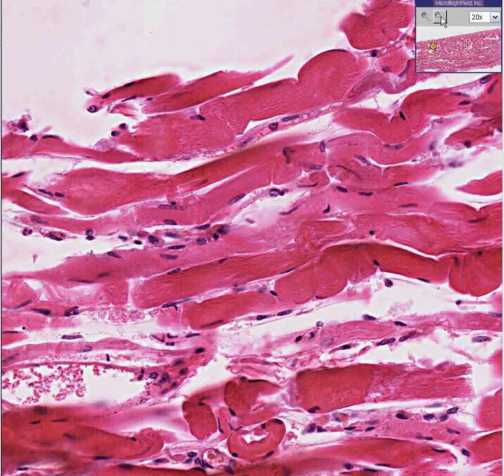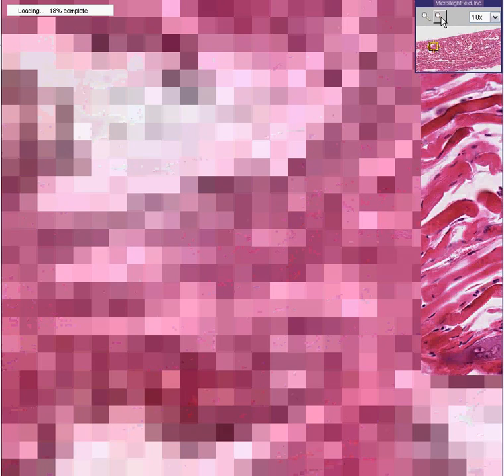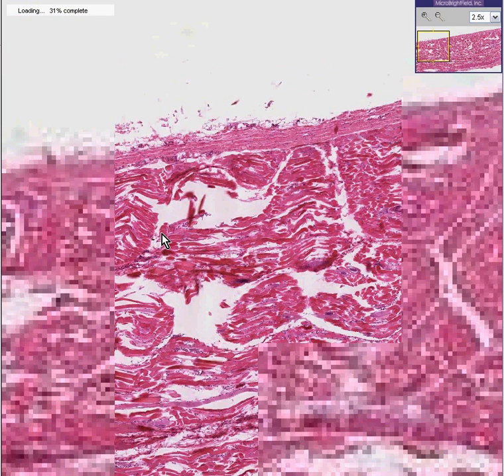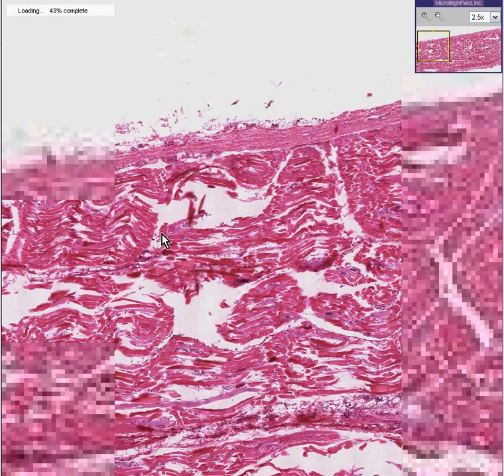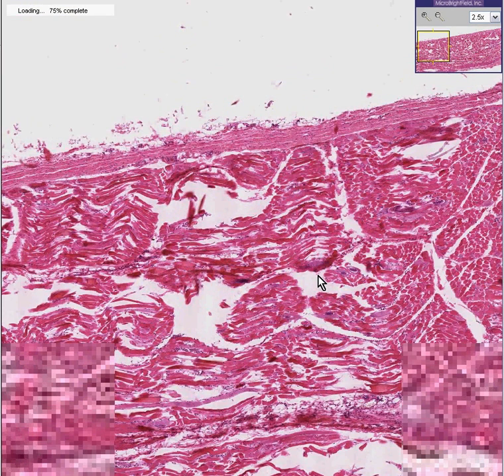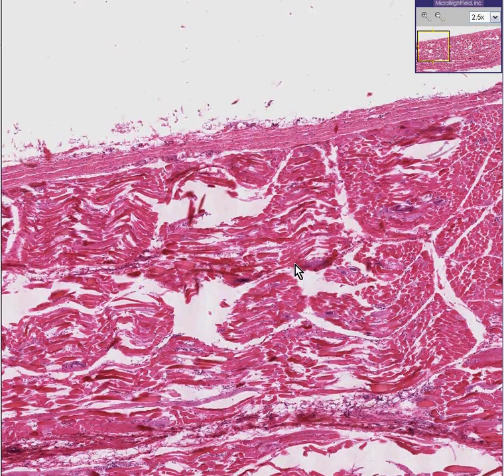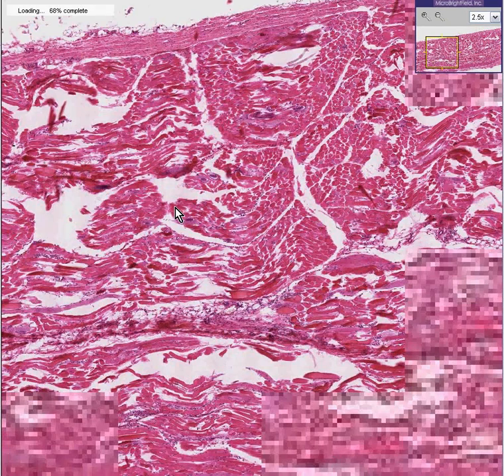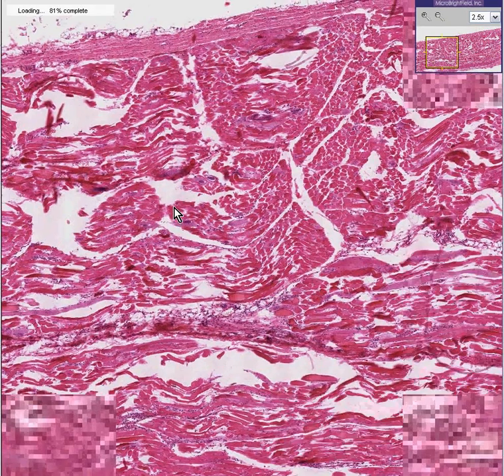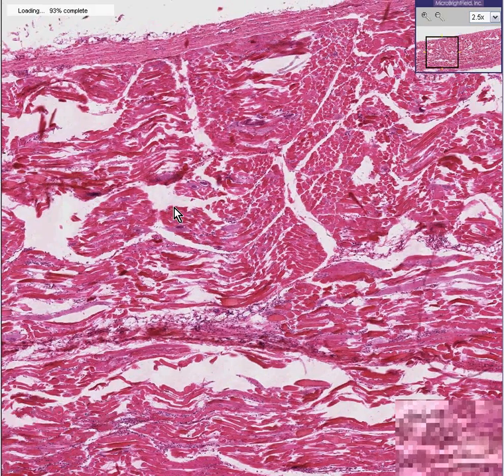But why did we zoom in so fast? Let's actually zoom out a couple notches right away, because one of the most common mistakes people make in pathology — especially neophytes — is that they zoom right away and they lose the forest for the trees.